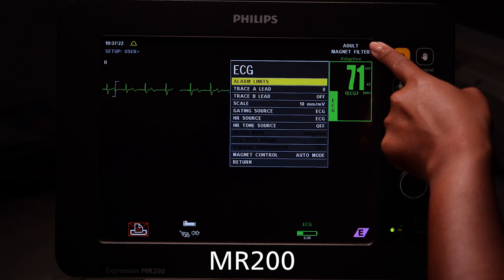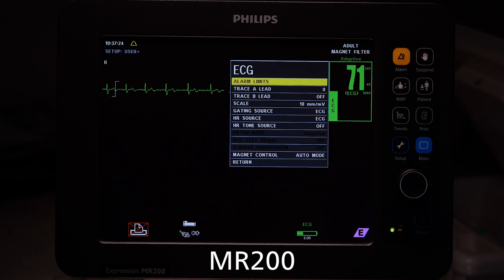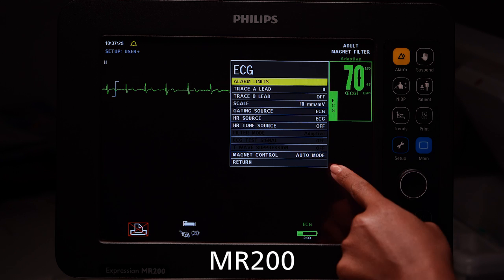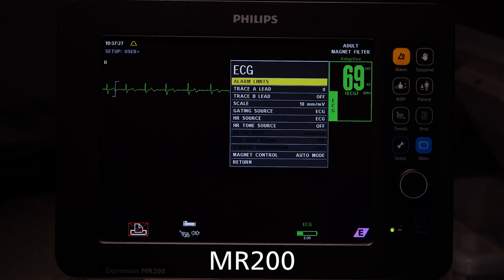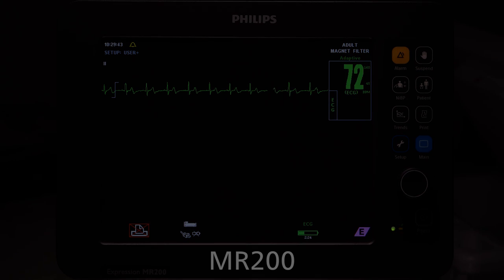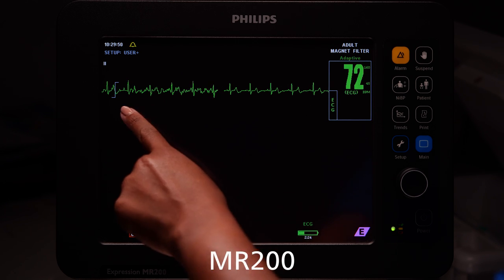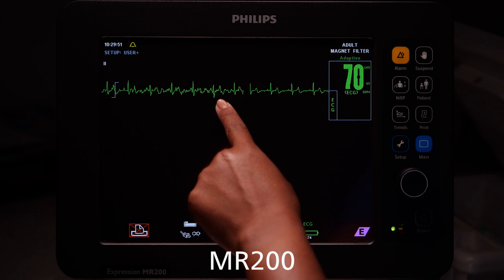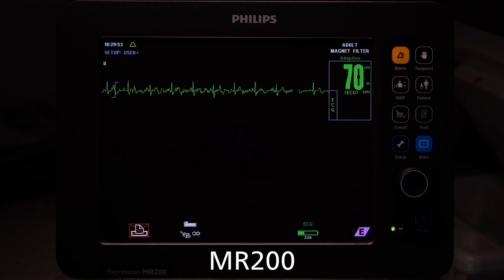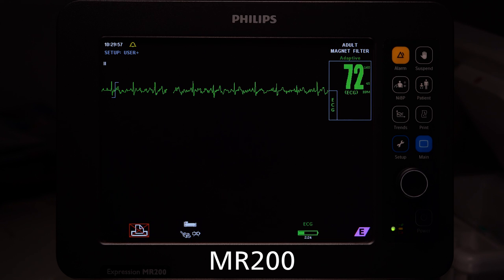Auto Magnet Control is the default setting for wireless gating on the MR200 and MR400. If there is excessive artifact in the ECG signal and Magnet Control is not producing usable triggering points, you can try using the Expression MR Monitor filtering.